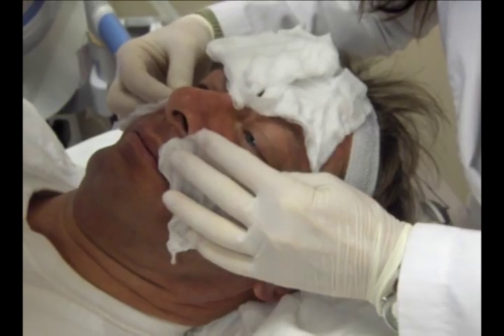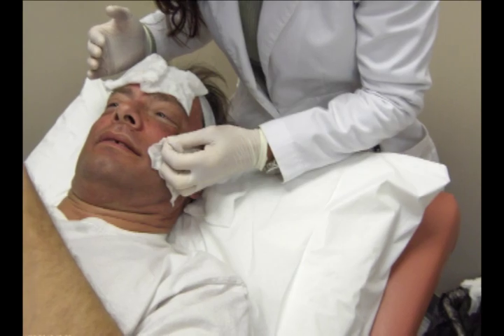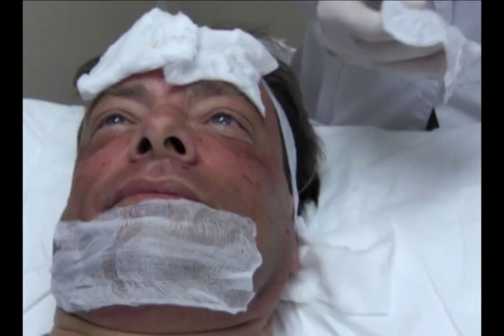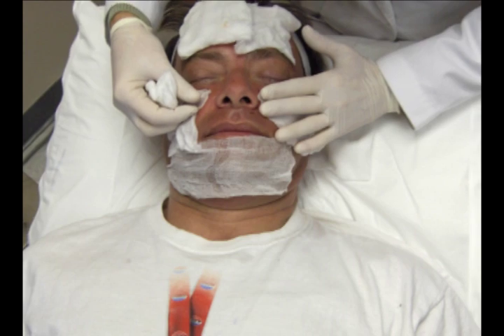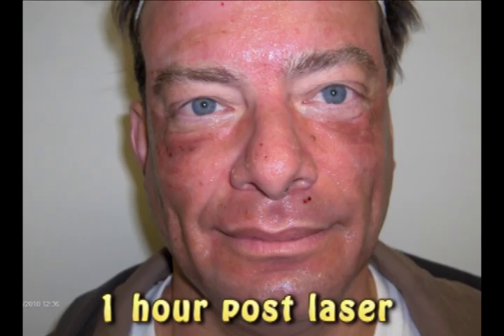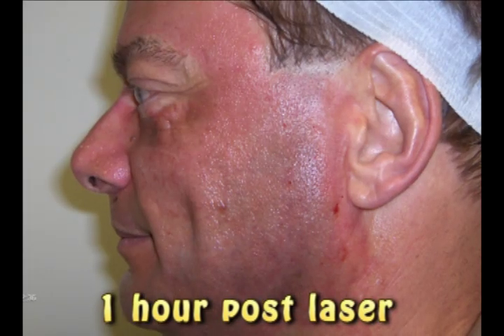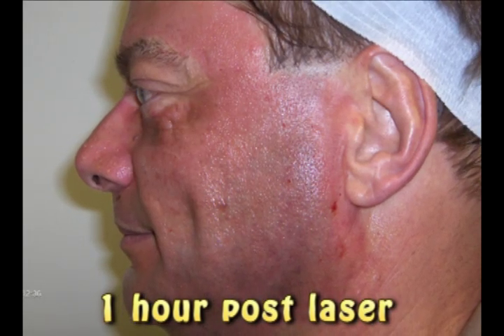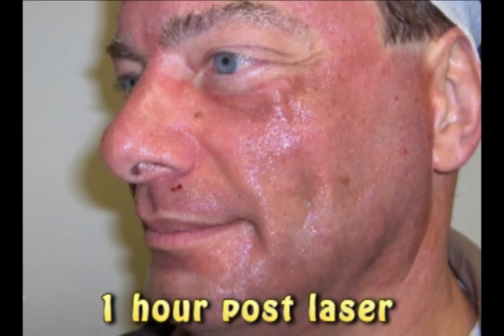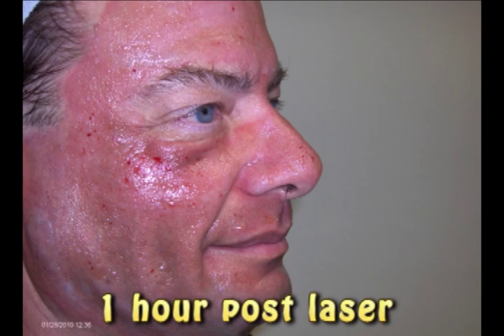Non-ablative requires several more treatments. Ablative resurfaces and stimulates the collagen. What the fractional laser does is remove little columns of skin that rapidly heal back together within about 12 hours, and then slough the rest of the skin. So it's a four-day downtime, but it really changes people's lives.